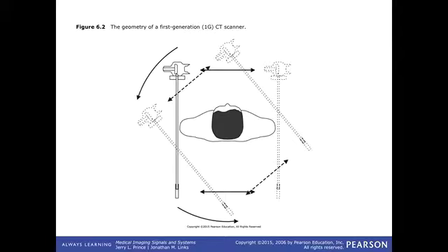And so all the engineers over the last 30 years have been working on CT technology to get to this point where you're making remarkably good pictures, right? And we'll see that the uptake of the use of CT has sort of exponentially grown, which is a cause for some concern, which we'll talk about briefly.